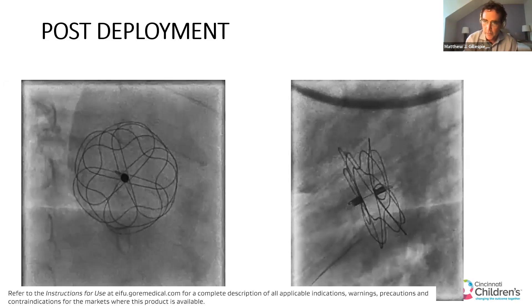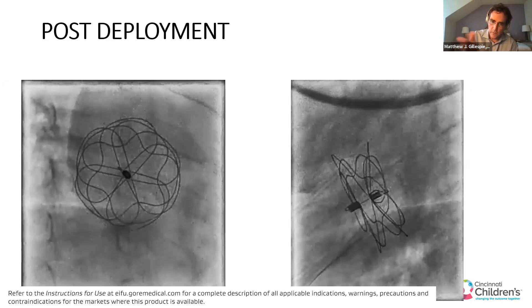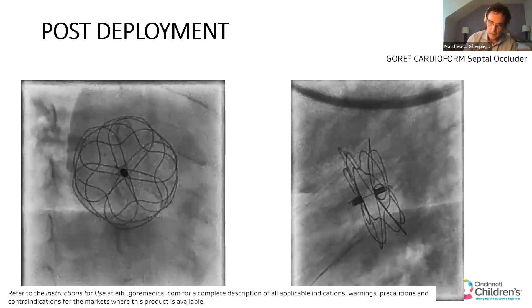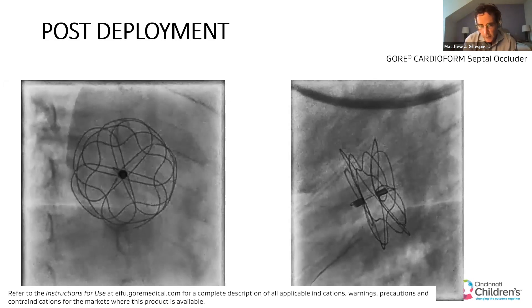Before I take the retrieval cord out, I do the interrogation, because with just the retrieval cord attached to the device, it will take this confirmation in the septum. And this is what you want to see with your echo.